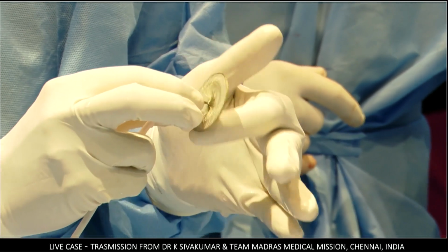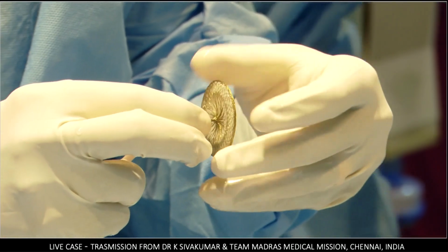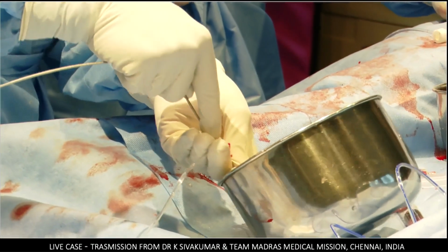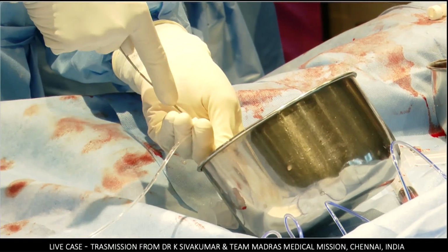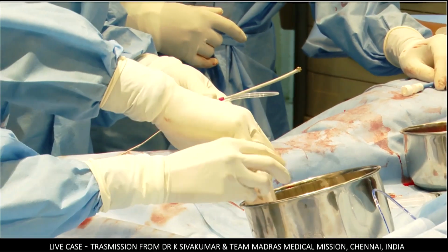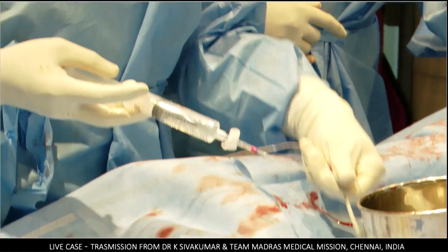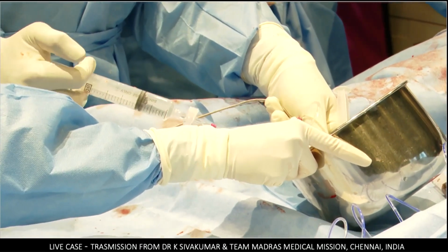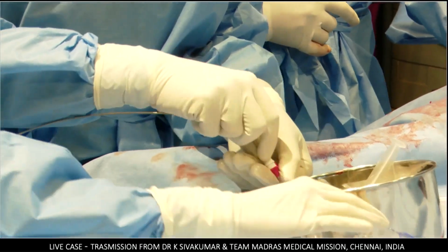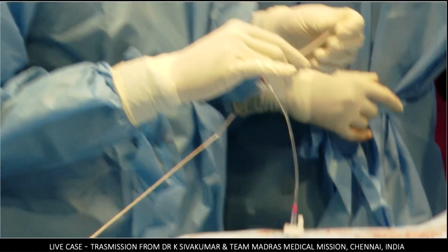Just a quick question, because it's very challenging anatomy in terms of the malaligned septum, and also there's a separation between septum primum and secundum. My gut feeling is that when you deploy the device, the disc on the left and the right side are likely going to flare. So I'm not sure whether you are considering using 3D imaging to show us that. That would be great if you can. Also, second thing, it looks as if this device is a little bit more flexible, so maybe it may conform better to this anatomy. I'm looking forward to seeing that. Thanks. Yeah, sure, Warrican.